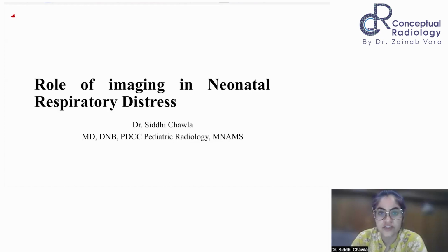And it's not just one imaging; follow-up X-rays are being done, and I'll advise you to always look at all the X-rays that are available to you and not just one X-ray. I have divided the role of imaging in neonatal respiratory distress into two parts. In part one, which we will cover today, we'll cover the medical causes of respiratory distress. In the second part, we'll deal with the complications of ventilation, as well as the surgical causes of respiratory distress, right?